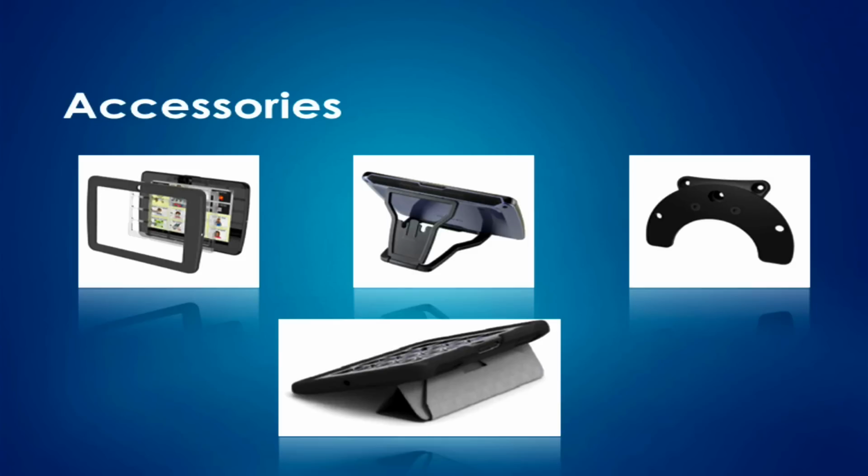Okay, we're getting close to wrapping up now. I just want to go through a few accessories that are available for the T10 device. So the T10, as I mentioned, is an Android tablet, and it has built-in speakers and has quite a large, loud volume. You can access that with a button at the top of the screen.